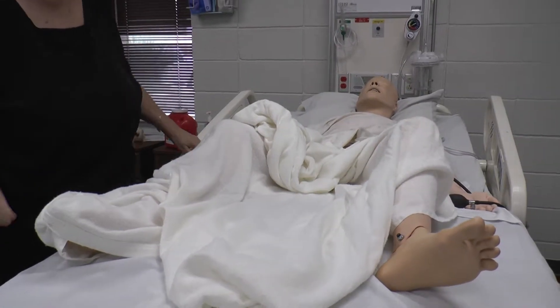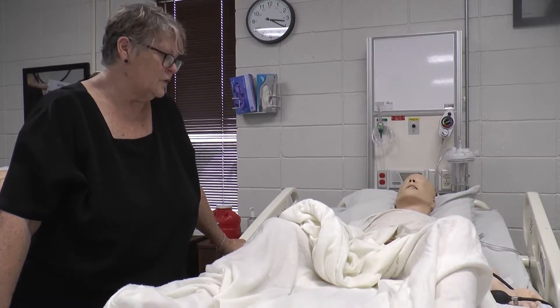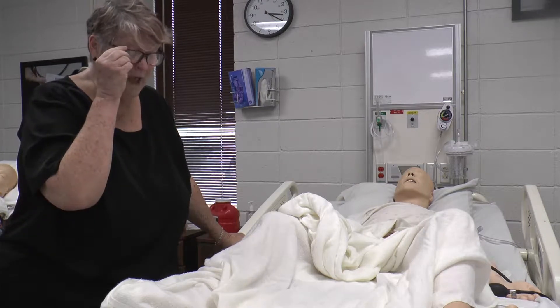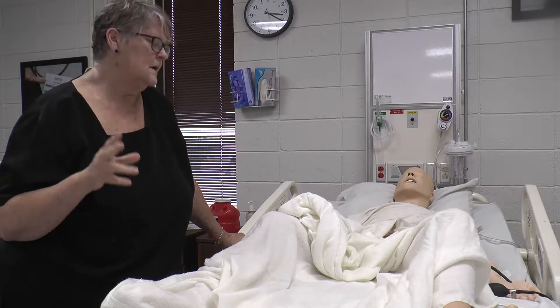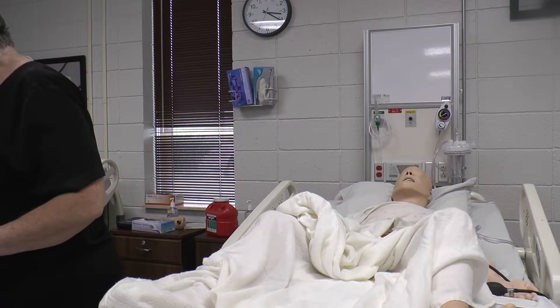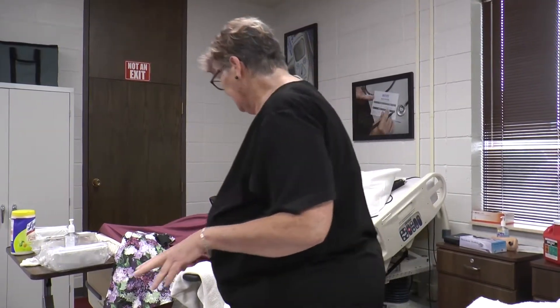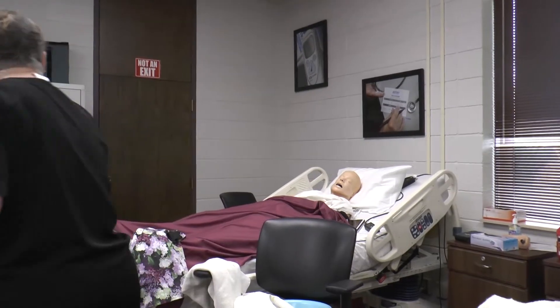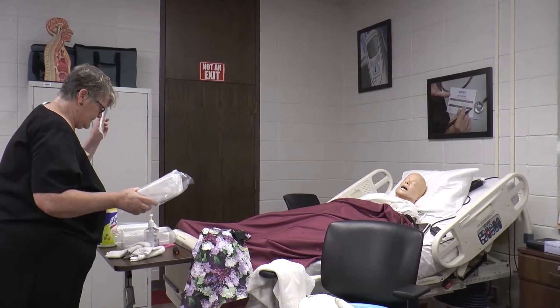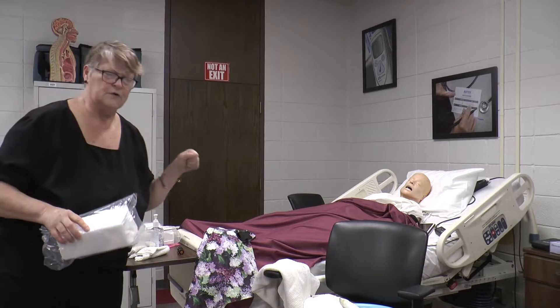I'm going to demonstrate male intermittent catheterization. If your nurse says they need a UA on a person that doesn't have a catheter, check your order first. Then gather your equipment, which includes soap, washcloths, a bath blanket — the basin is in the room — two catheter trays, and extra sterile gloves.